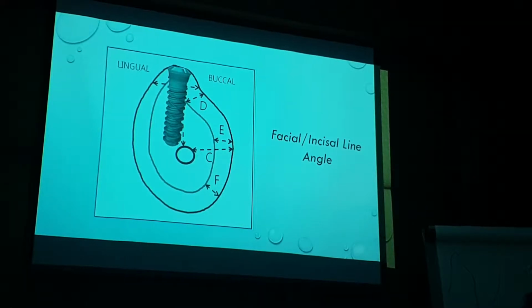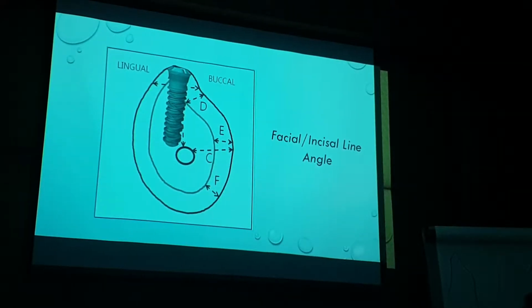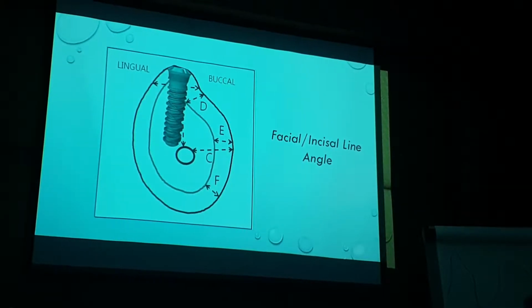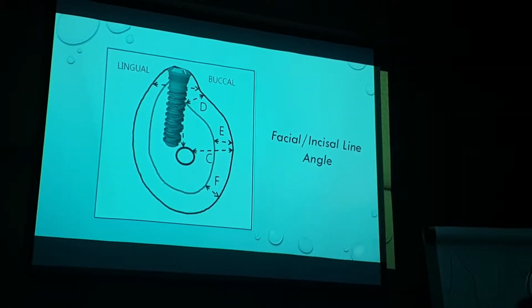We can place a more narrow implant to be within the confines of that bone. A lot of people do that. They're faced with a ridge that looks like this. You realize that you're going to have to use an implant that's smaller in diameter, so you want to maximize its length to compensate for that, right? We all do it every day.